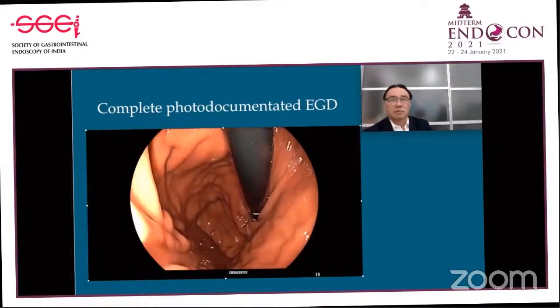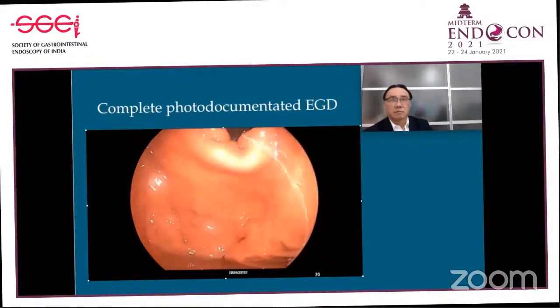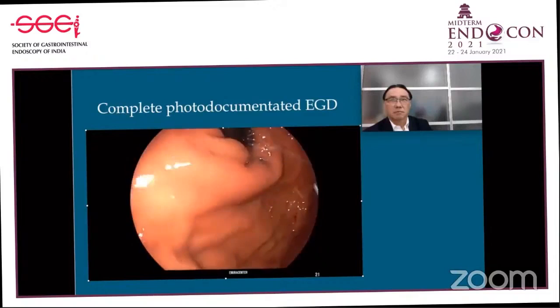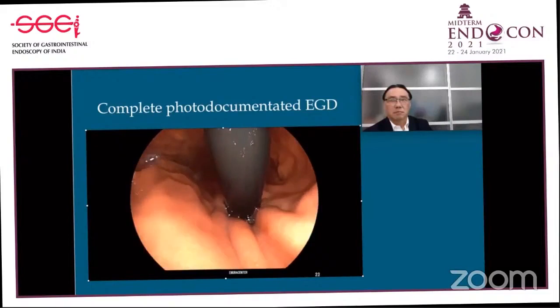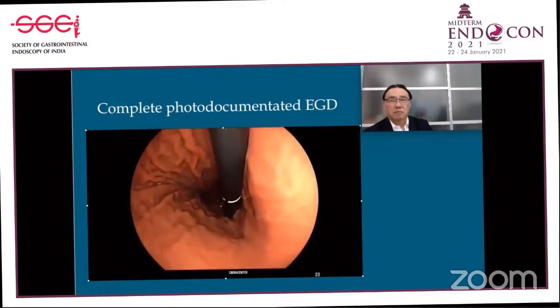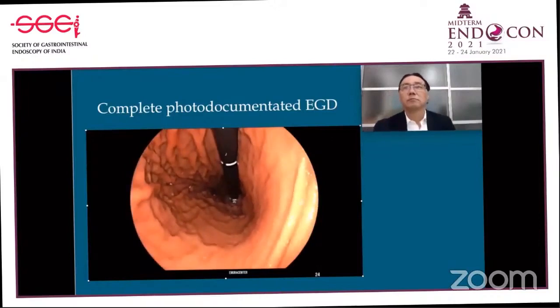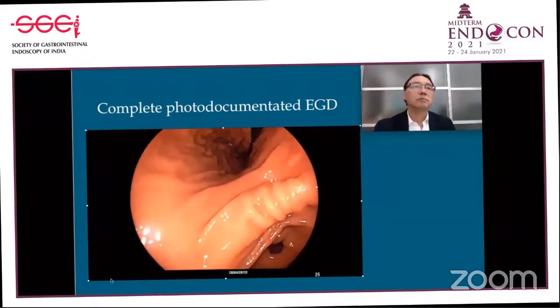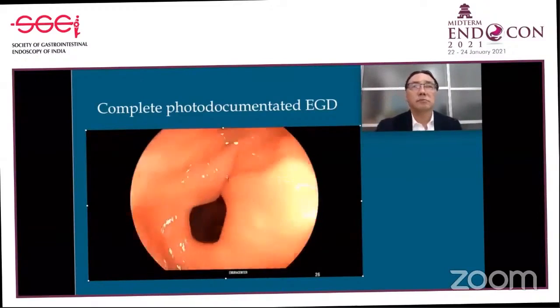and posterior walls of the upper third in one shot, area 20, then the fornix, area 21, the posterior aspect of the cardia, area 22, and the lesser curvature is examined with a close-up view of the upper third, area 23, then the middle third, area 24, the lower third, area 25, and lastly, by rotating the small wheel clockwise, a view of the entire incisura angularis is captured, area 26.